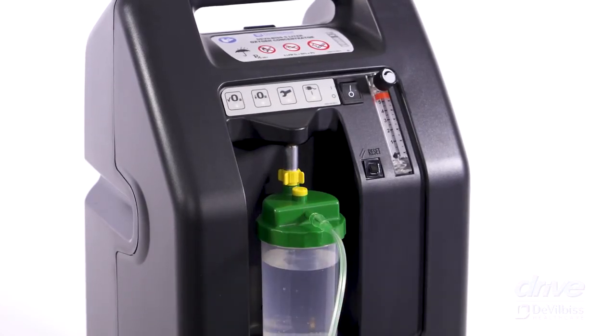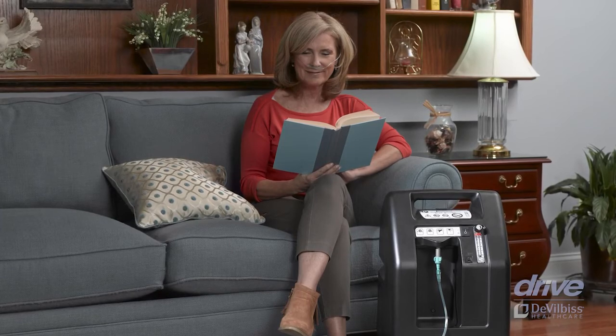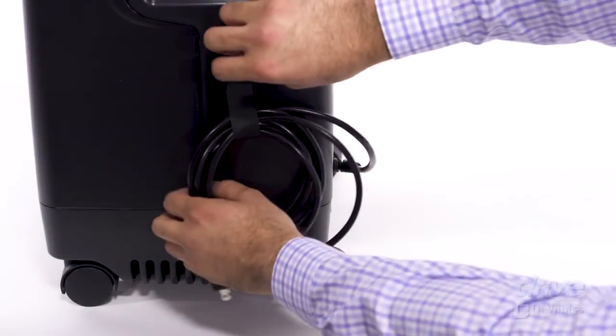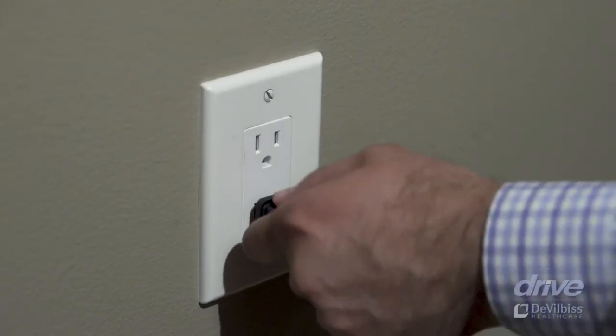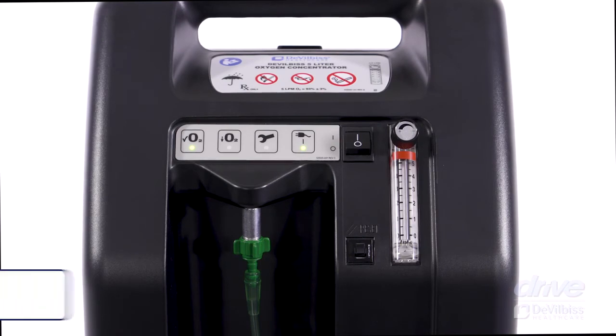If your oxygen tubing is not already connected to a cannula, you or your provider may do so with a tubing extension connector. Remove the power cord from the line cord strap and plug the cord into the wall outlet. Turn the power switch to on. All the lights will illuminate briefly and a brief audible signal will sound.